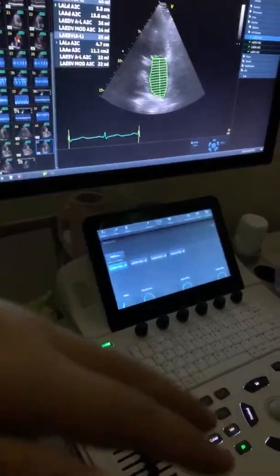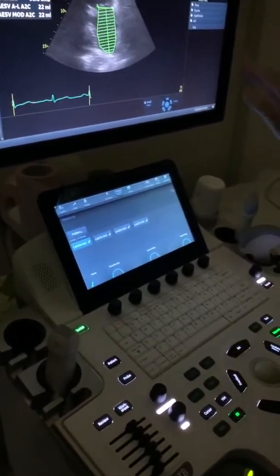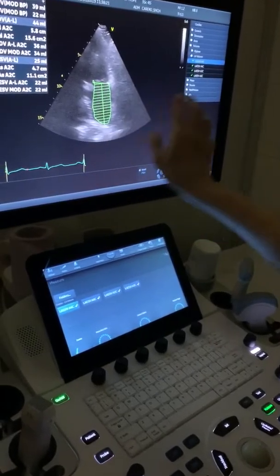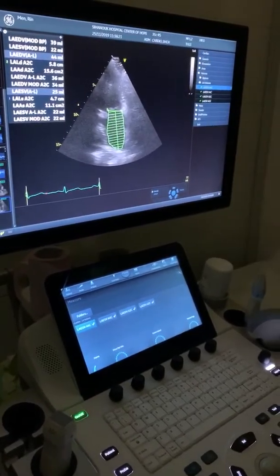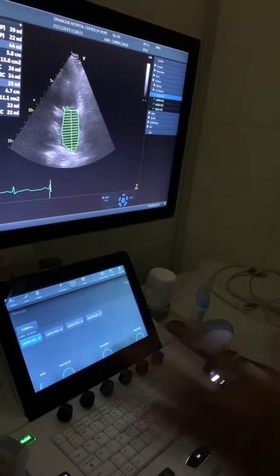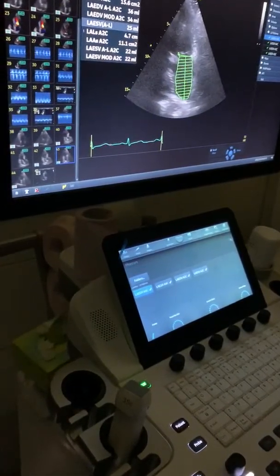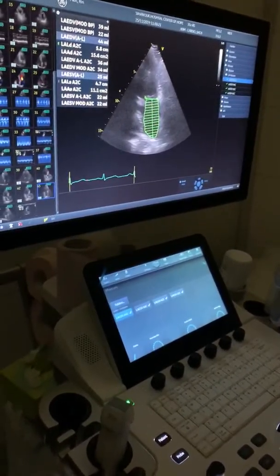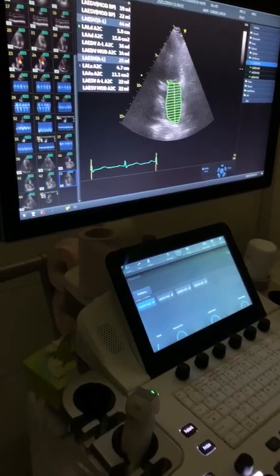So how can you go to select? No, select. Yes, you can still select. Move. So here. No, but the valve has to be closed. Okay, looks like it's not clear. It's not clear. Can we see? Not really closed. Okay, this is systole.